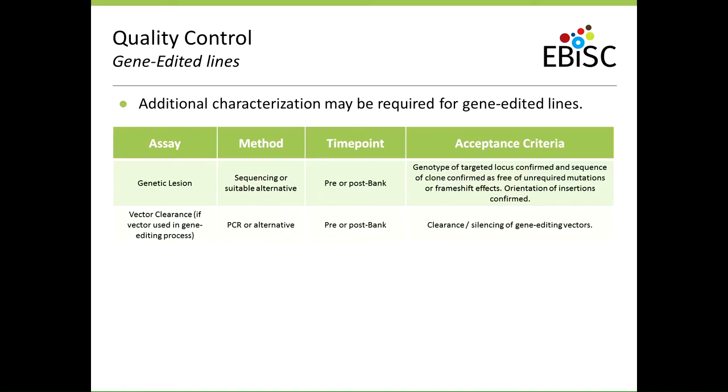The one that Kevin spoke about briefly earlier was that when EBiSC started, we didn't have any gene-edited lines coming in. So obviously that had to be taken into consideration. Like I said, the question was asked earlier about, are you checking for genetic lesions? And obviously, ideally, you do. And also, you would look for vector clearance as well.